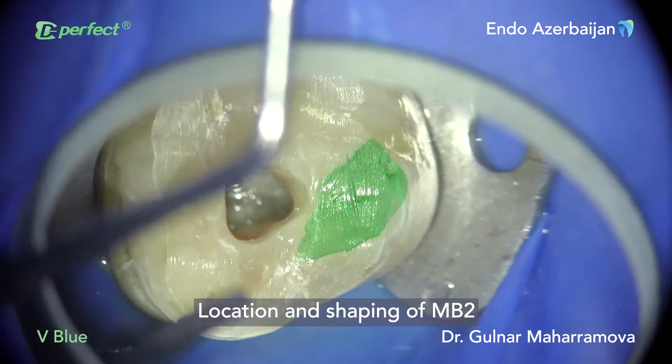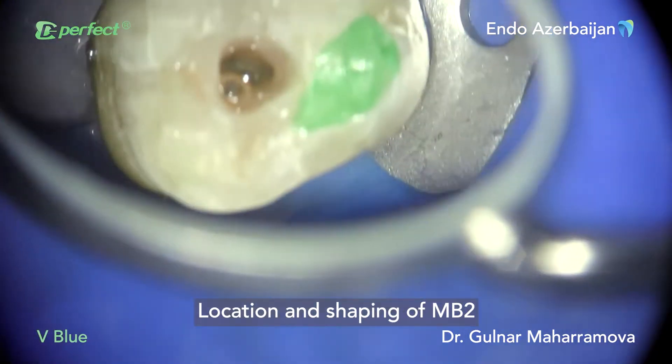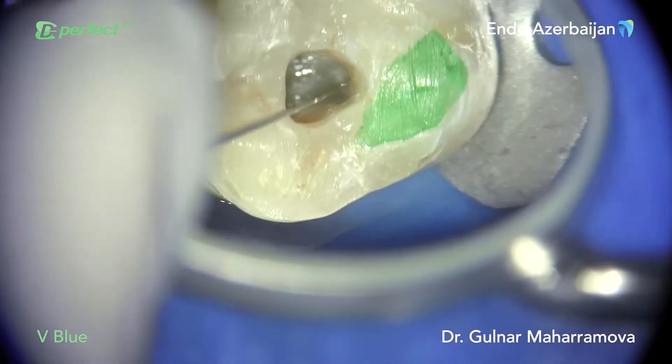Note the debris in the flutes, which is even more visible because of the contrasting blue color of the file. The next step was to locate and shape the MB2 canal. For this purpose, I put a mark on the palatal wall of the tooth since the MB2 orifice appeared to be next to the orifice of the palatal canal.